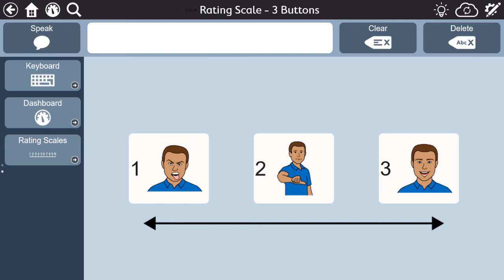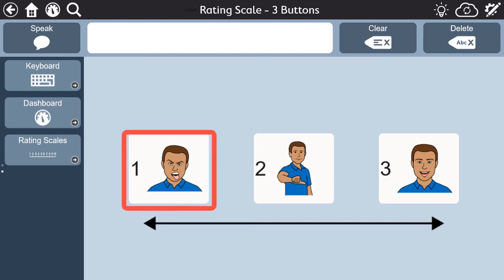As with all the tools available within the aphasia pages in Snapcore First, the rating scales are meant to be used by all people participating in the conversation. As the communication partner, be sure you also share your own response — especially if you disagreed about how good that movie was.